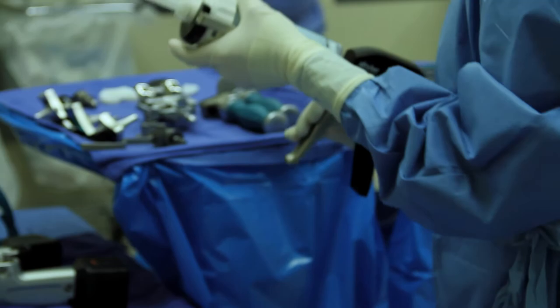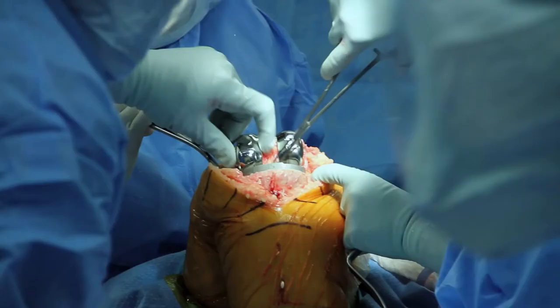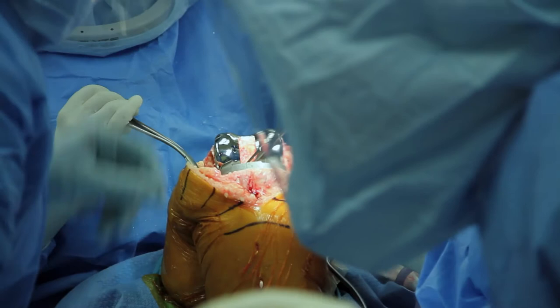Once the joint kinematics have been optimized with the trial prosthesis in place, the trial is removed and the knee is prepared for the final prosthesis. This is done with bone cement — the tibial component is cemented, and then the femoral component is cemented. Any excess cement is removed from the joint and a polyethylene insert is attached to the tibial tray, which ultimately serves as the bearing surface for the joint.